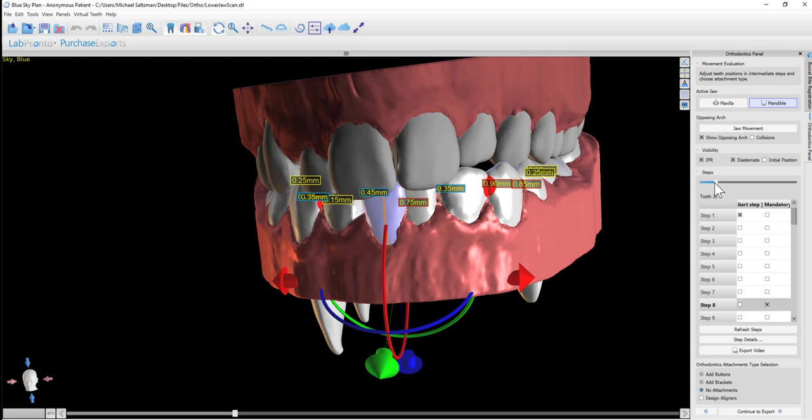Bi-weekly, of course, will have more steps than monthly will. Each aligner, each model, will have a smaller amount of movement from step to step. But overall, the number of models or the number of aligners will have increased.